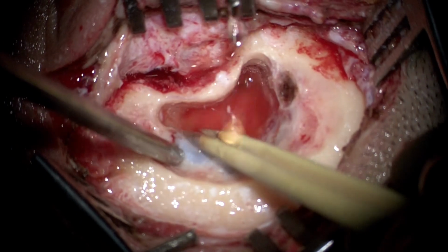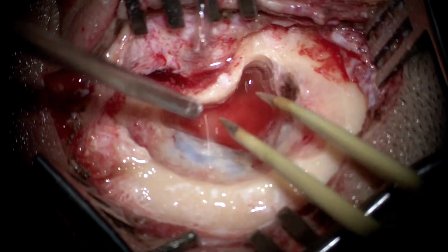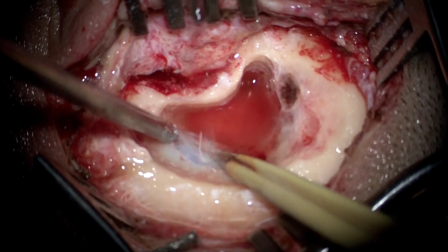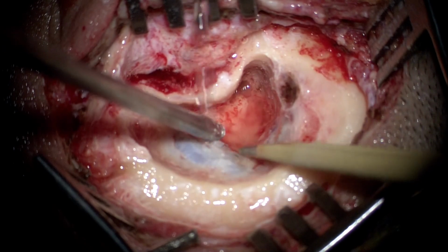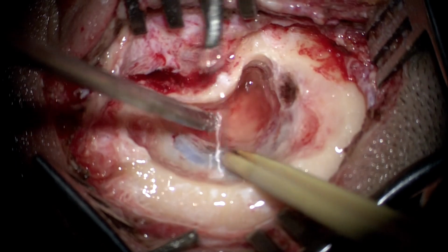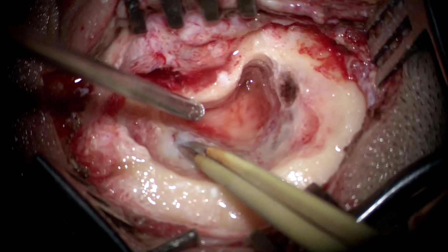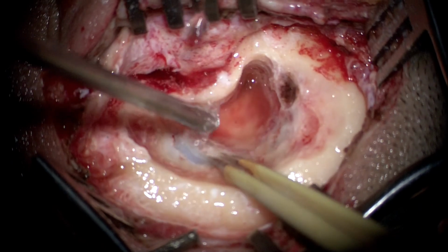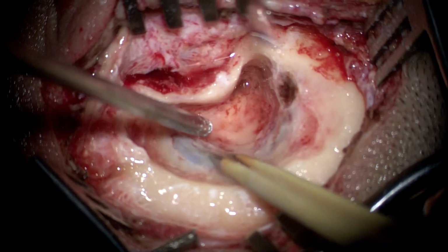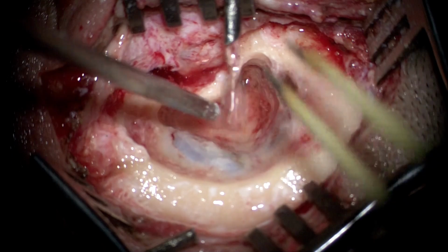So once again, with some more exposure of the bone anterior to the sinus, we are trying to see if we can achieve another 1 to 2 millimeters of sinus decompression. And like I said initially, without further exposure of the posterior bone of the sigmoid sinus and the retrosinus dura, or the bone inferior to the sigmoid sinus, this is the maximum amount of decompression we could achieve with this much bone exposure. And as of now, this appears to be just adequate to begin our definitive labyrinthectomy procedure.